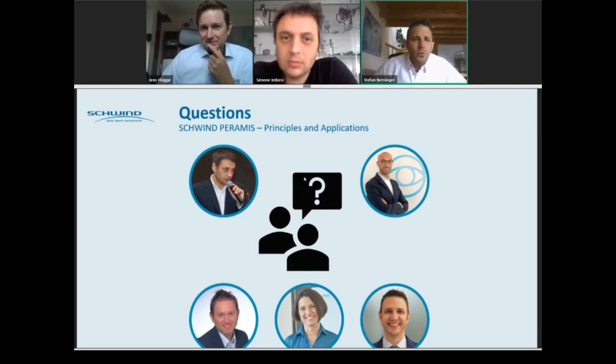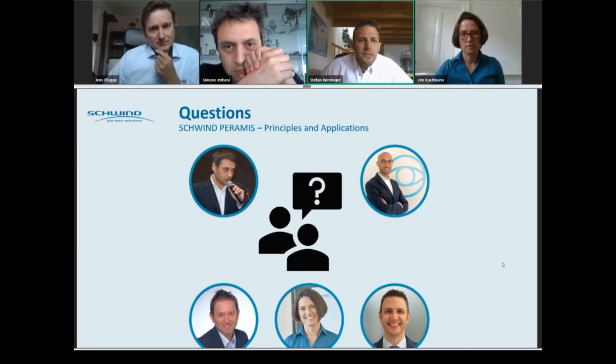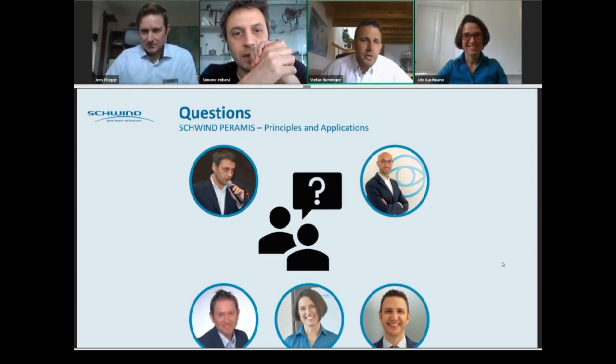The question is, so one large spot consisting of perfectly uniform pixels is projected to the retina. Then it goes back to the pyramid as an image of the retina, where it is separated into 4 pictures, which each represent 4 quadrants. So basically, each pixel can be seen from 4 different perspectives, thus measuring its deviation from the perfect wavefront. Correct? Yes, correct.